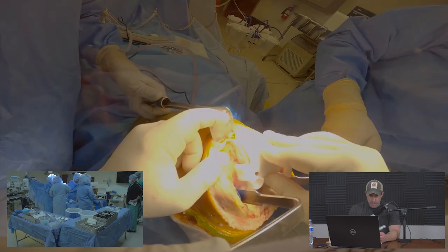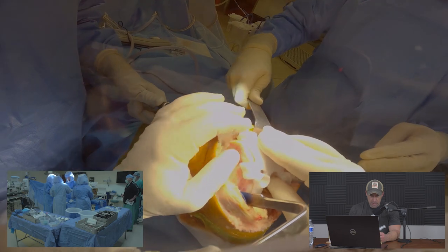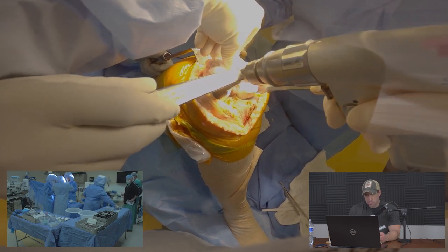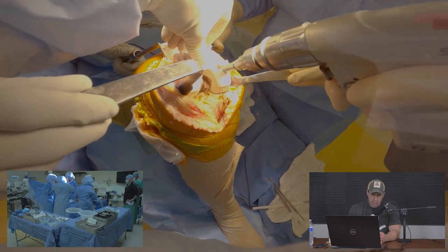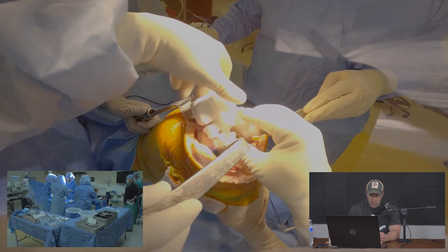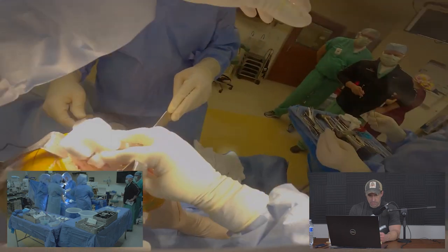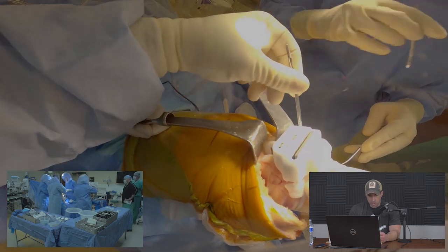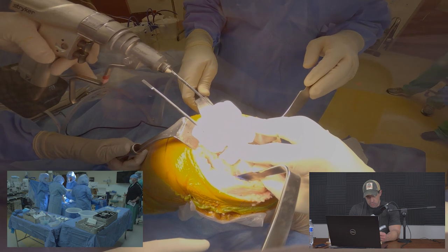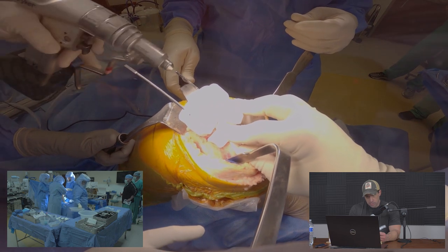This is the F1 guide — a 3D printed guide that specifically fits this patient's bone and basically snaps right into position because it's contoured exactly to their anatomy. After clearing cartilage and referencing off bone, we apply the F2-F3 combination guide which locks directly into position and fits in exactly one place, then use pins to hold it securely.